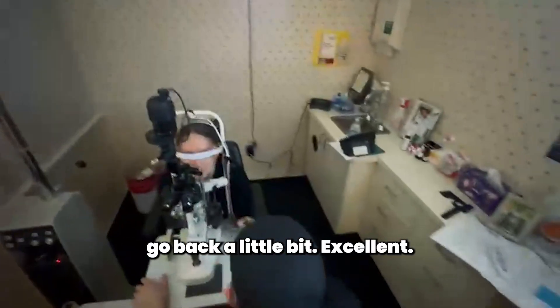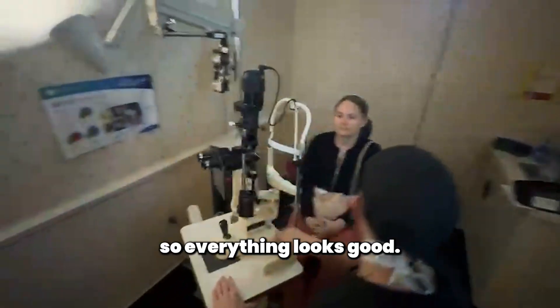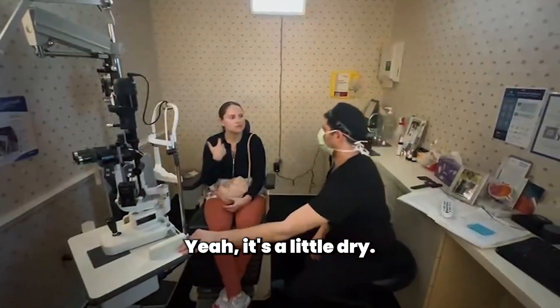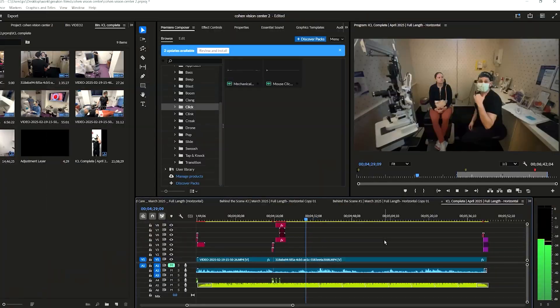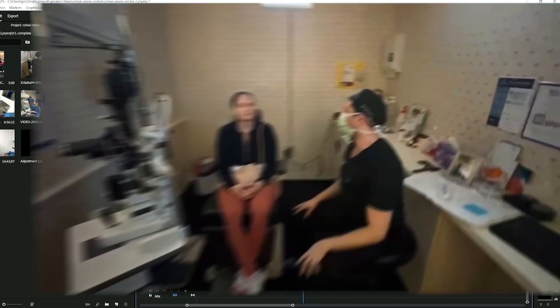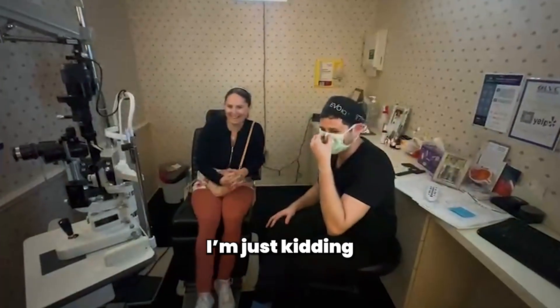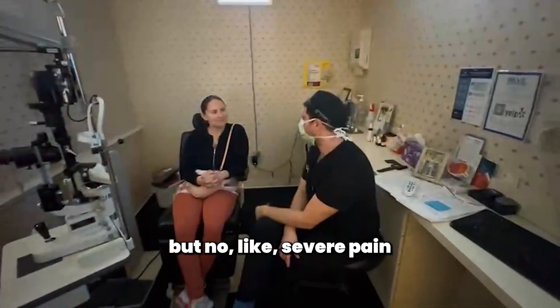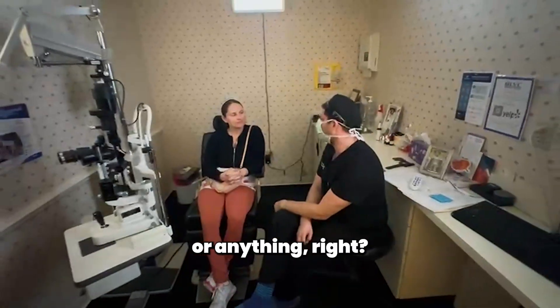Blink a little bit. So everything looks good. Are you having any pain or discomfort? Feel a little dry. Dryness is okay, but no severe pain or aching or anything? No.